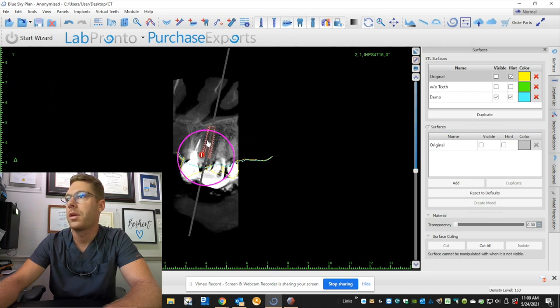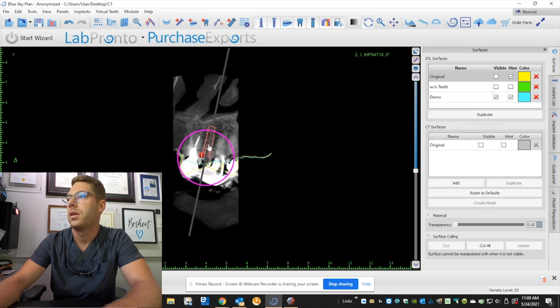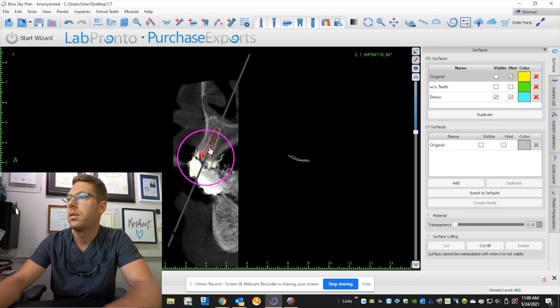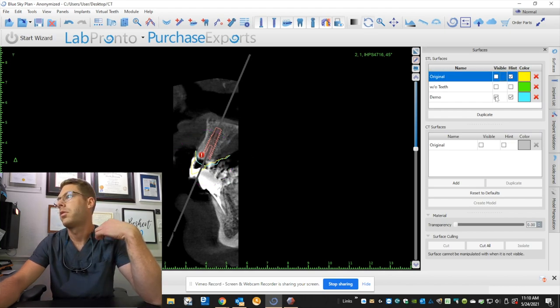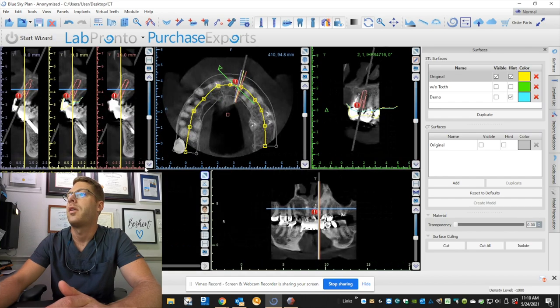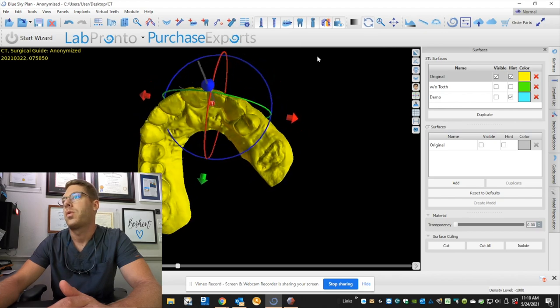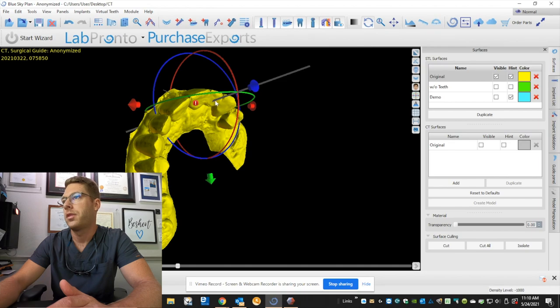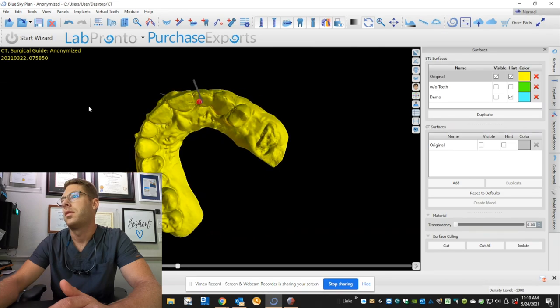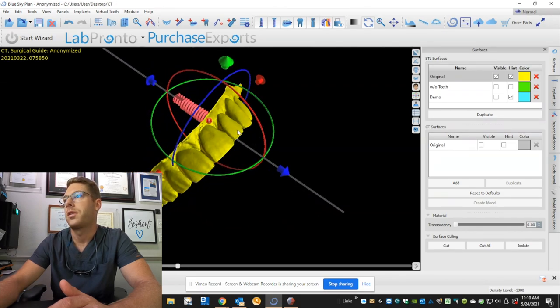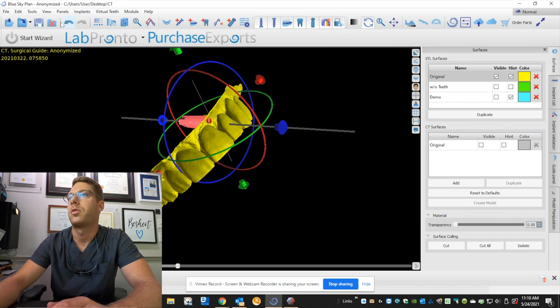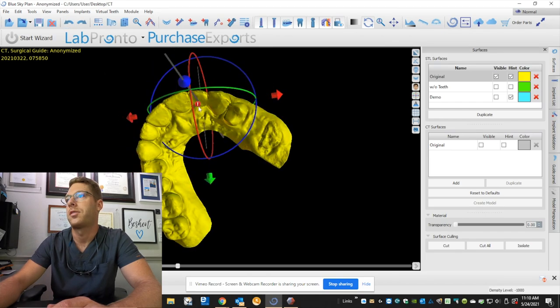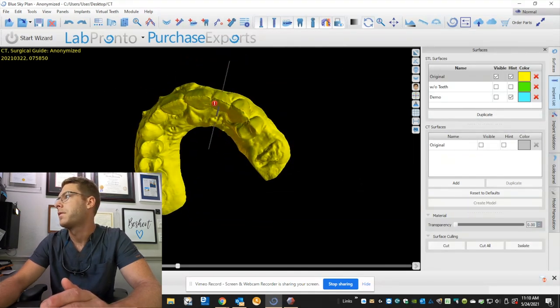So I am gonna be root banking number nine, meaning I'm gonna leave the root in the mouth, because otherwise you can get a lot of bone loss in those areas, and it actually has a lot of repercussions of taking the tooth out. It's difficult to salvage the bone once it's already been lost. So now I go and I check where it's coming out of the previous teeth. This is perfect. I want it coming out exactly out of the lingual, or tongue side of the teeth, because if it's coming out the front like this, the end product, it's gonna be difficult for the restorative dentist to restore this. So I always like to hide my access holes on the tongue side, because we want it to look nice and pretty coming out the front.